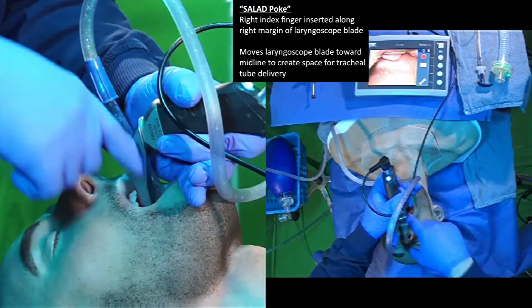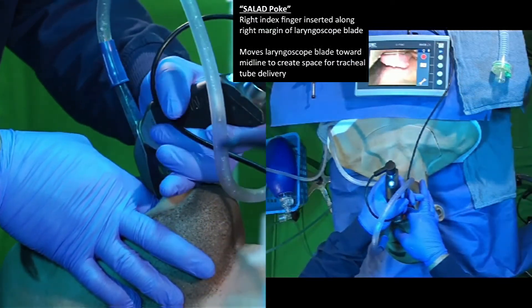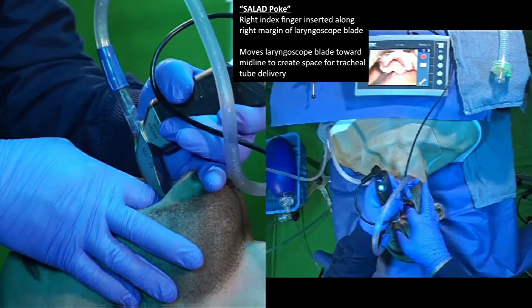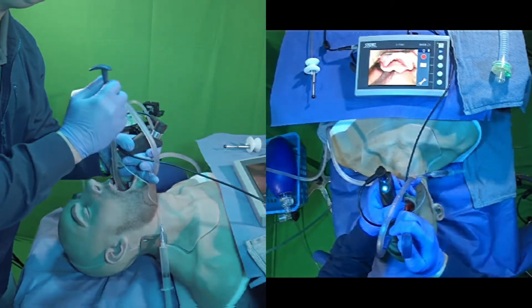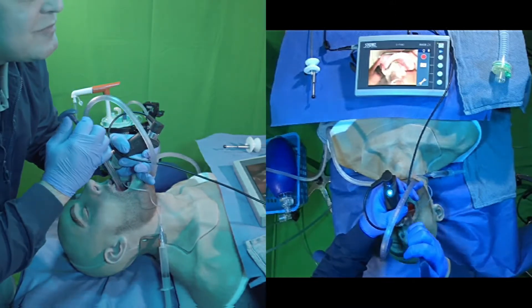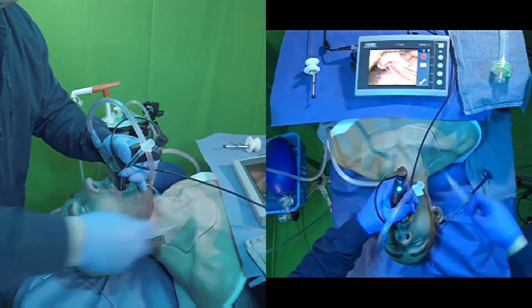Using that little technique, we can insert our index finger into the mouth, push our blade and the DuCanto catheter all the way to the left side of the mouth. So we have plenty of room to get our endotracheal tube into the mouth, placing the airway, and completing our intubation.